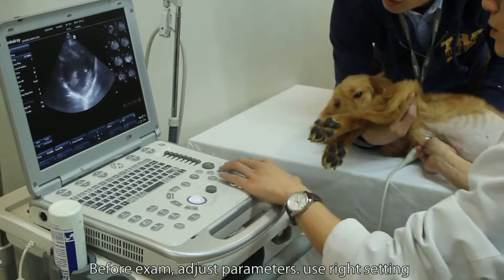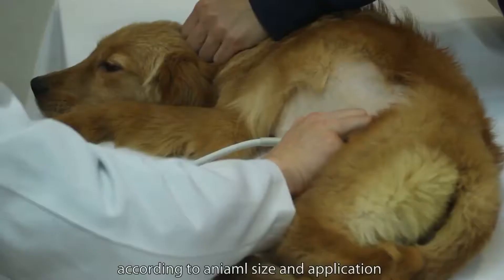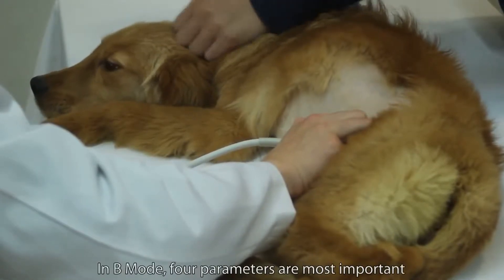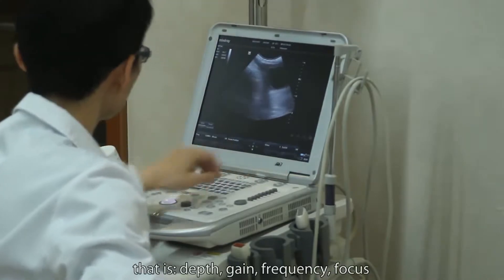Before conducting the examination, adjust parameters and use the right settings according to animal size and application. In B mode, four parameters are most important: depth, gain, frequency, and focus.